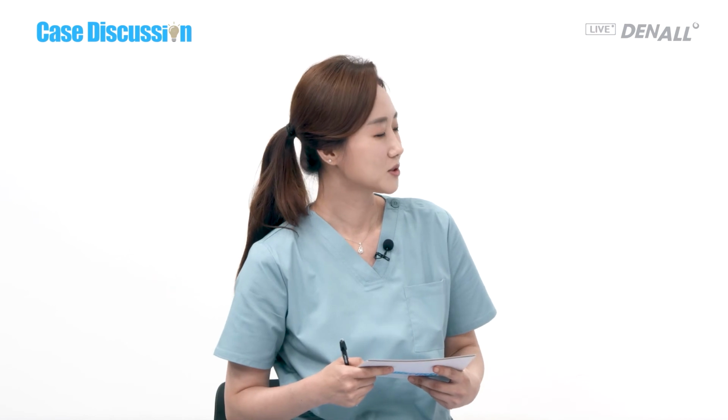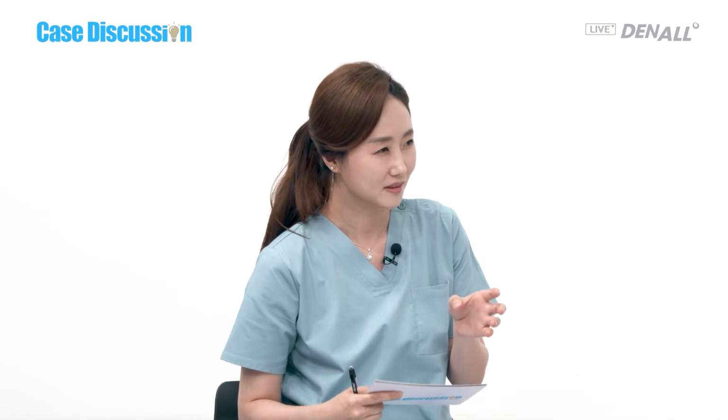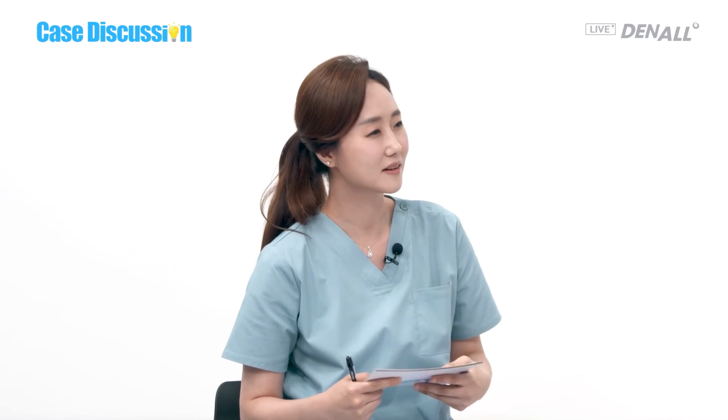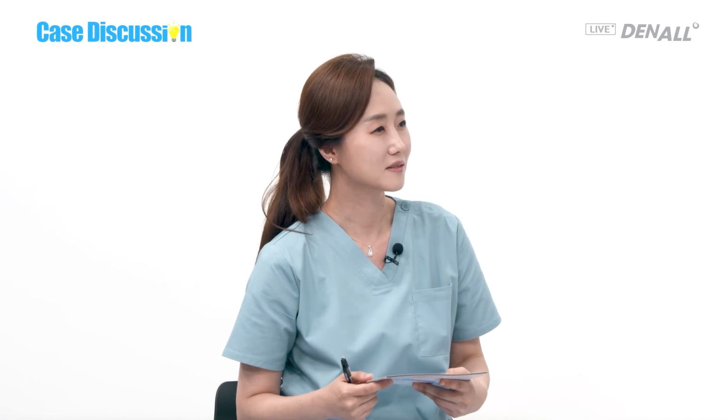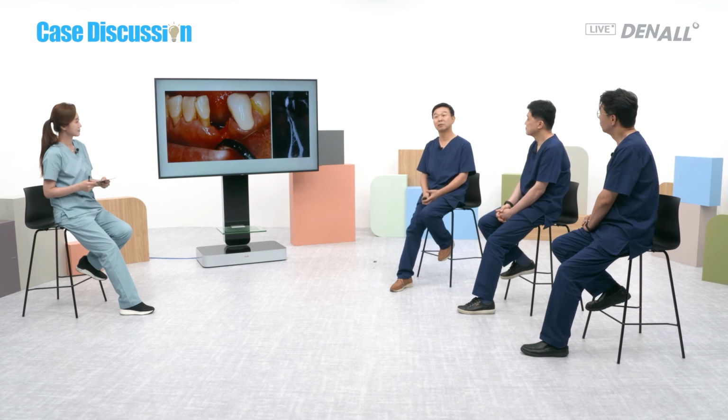Thank you very much. I have experience in placing MS implants. There is bone width to place the implant, but the angulation was not quite right. One of the disadvantages of using MS implants is that you cannot adjust the angulation. So, in serious cases, when the angulation is off after placing the implant, I grind off the top portion with a burr. Dr. Yang, what do you think about MS?